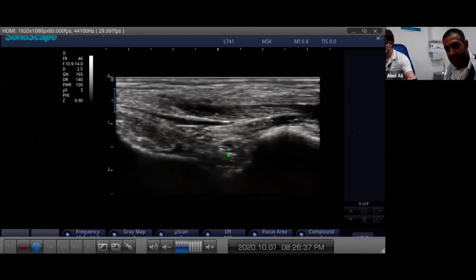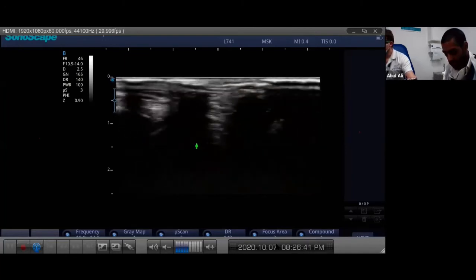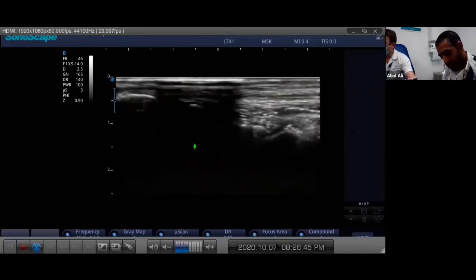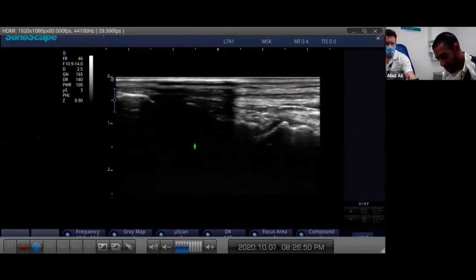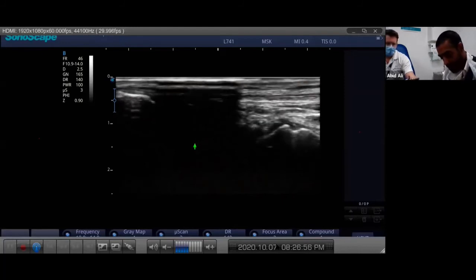My favorite joint - the talonavicular - and then you're onto the head of the talus. We'll stop there because we don't want to go into ankle territory which is the next joint up. I'll just show you quickly - you can just see the anterior ankle recess here, this nice V-shape. We'll come right back down now, staying in the longitudinal plane.